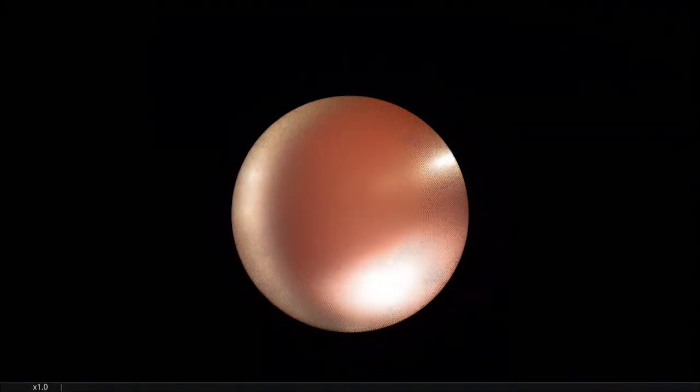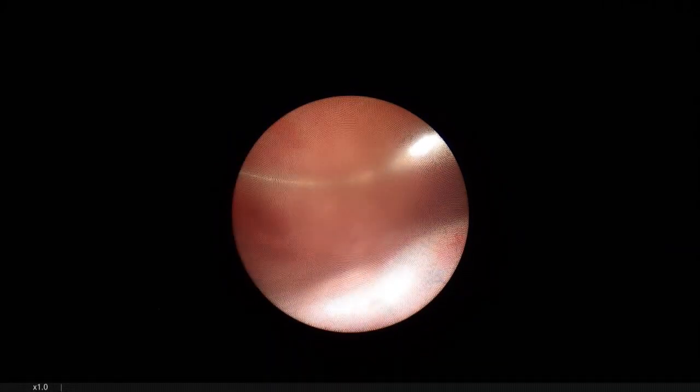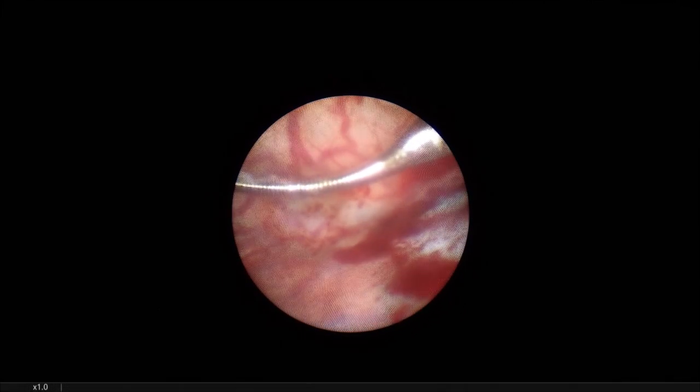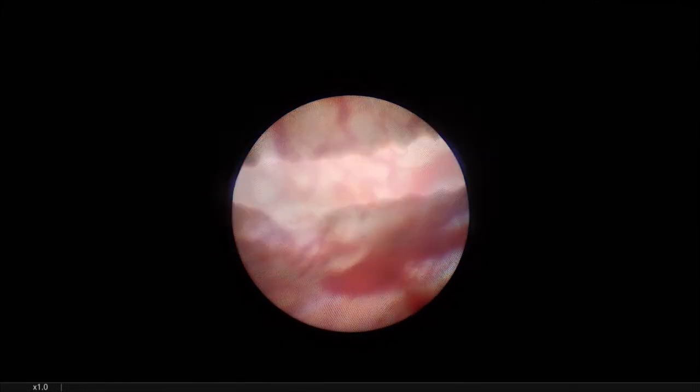There's the tip of the Amplatz sheath. You can see? Yes. This is the renal pelvis. And this is the point where I am going to remove the guide wire.